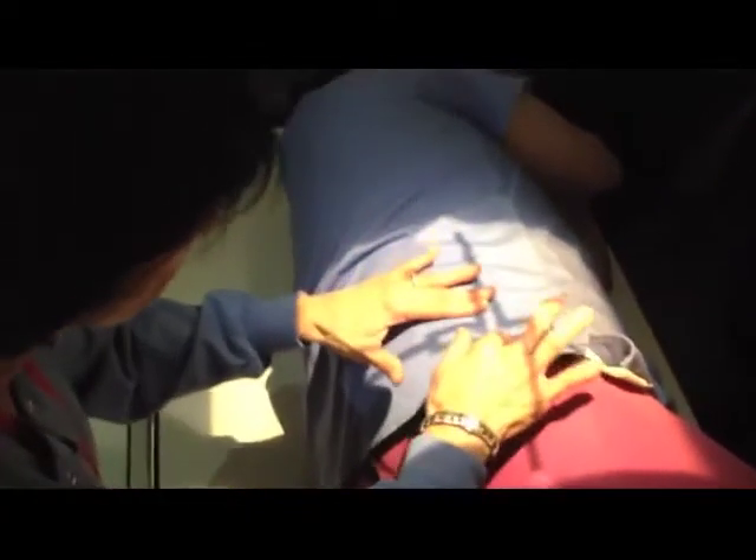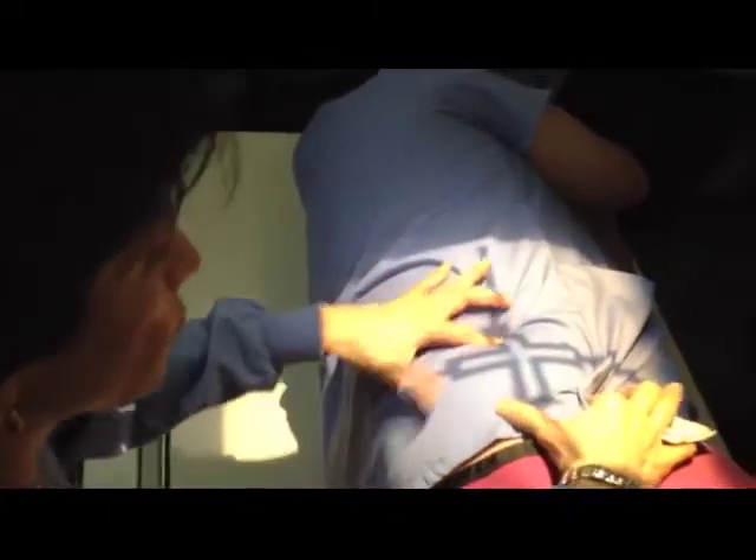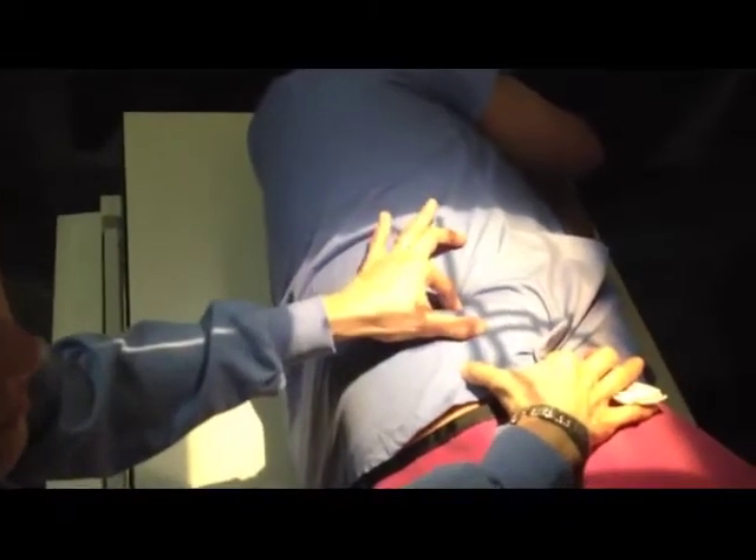Okay, now we're going to do a spot. The same thing. Now remember, his spine goes like this, and then his sacrum is going to come and turn this way. So this line is probably going to be slightly behind. What do I do? I feel crest, and then I just kind of do that. But I don't just stop there — I start feeling ASIS, and make sure that it's halfway between ASIS and crest. Because sometimes when I do this, I end up being way up at crest or too low.